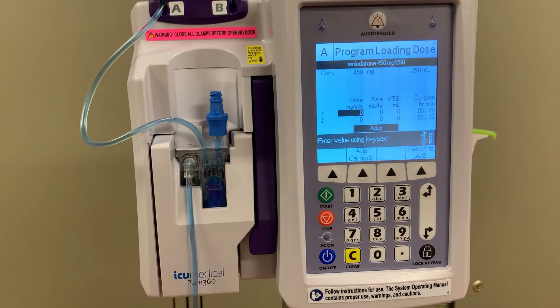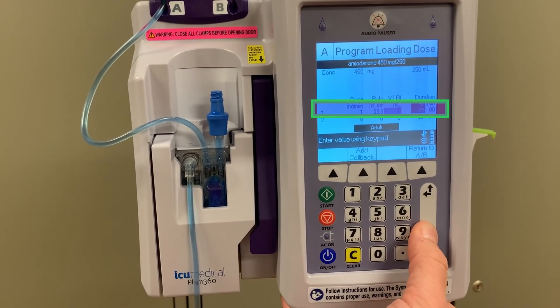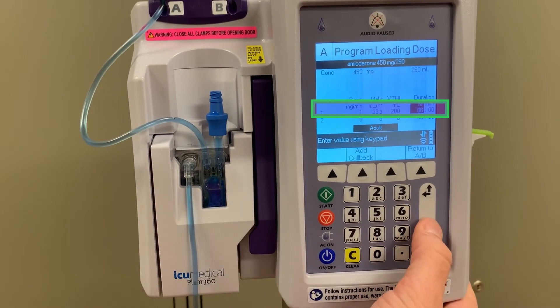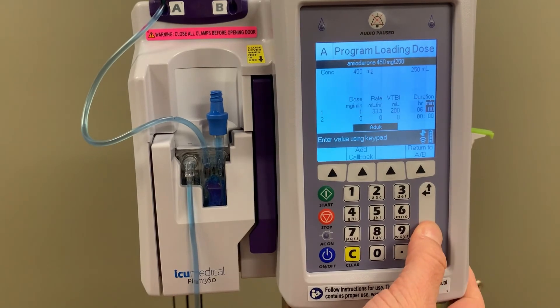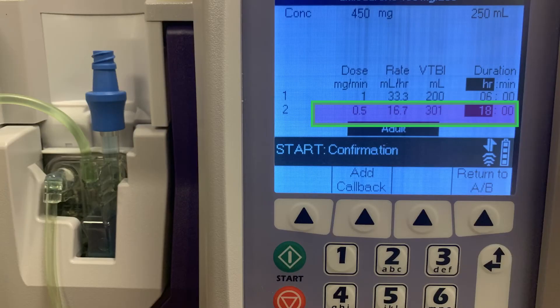For this example, we will program amiodarone. Amiodarone is administered in two different doses over the course of 24 hours. The initial dose is 1 mg per minute for 6 hours, so in line 1 we will enter 1 mg per minute for dose and 6 hours in the duration field. The other fields will autofill to complete the program. After the first 6 hours, the medication is decreased to 0.5 mg per minute for the next 18 hours, so we will enter 0.5 mg per minute and 18 hours to autofill the remaining fields.